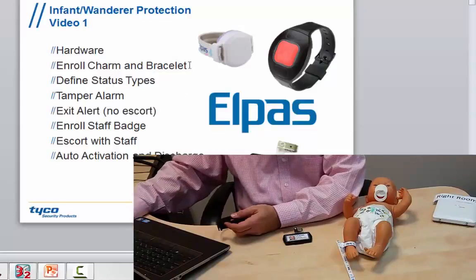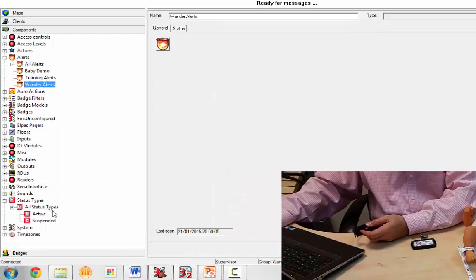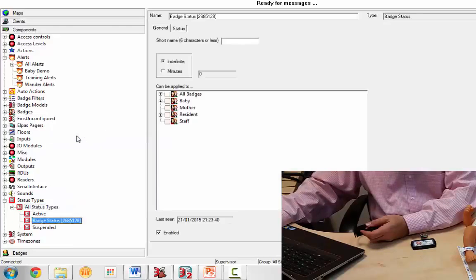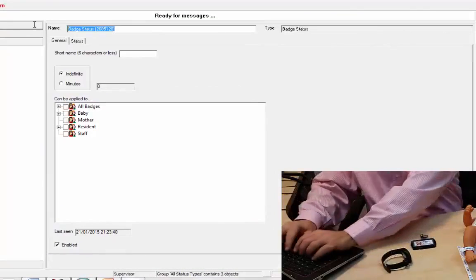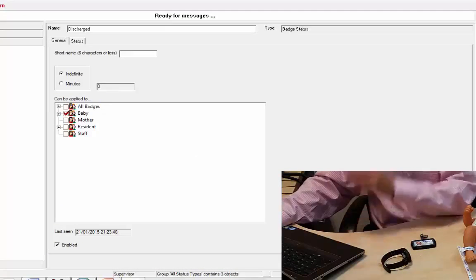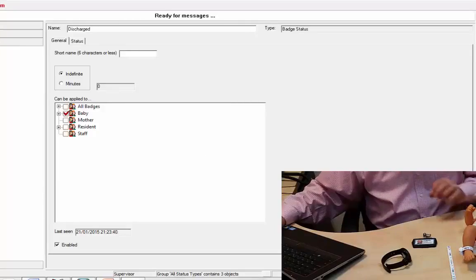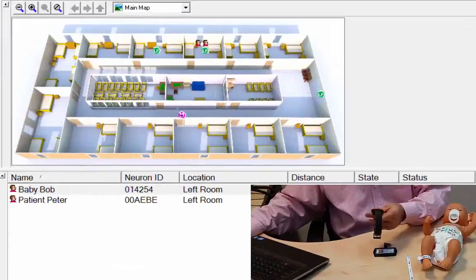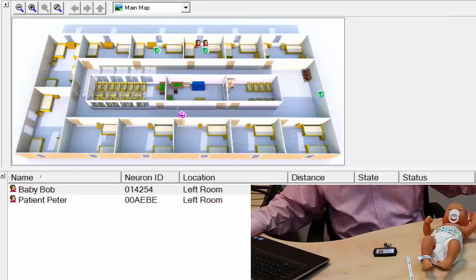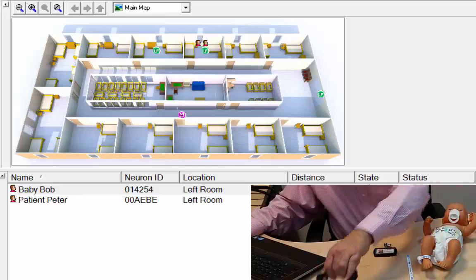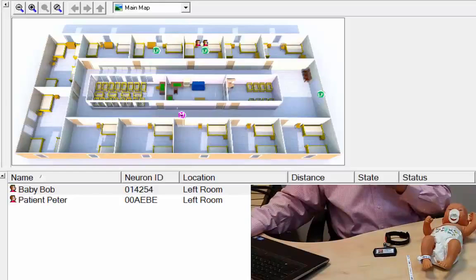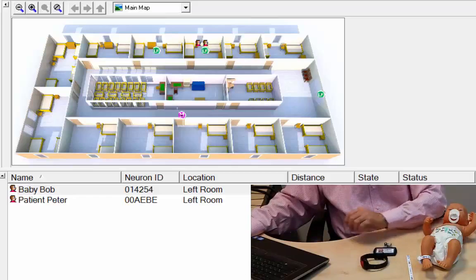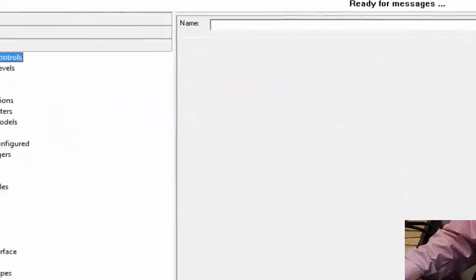We're going to define status types. So if we go down into our status types, we're going to add a badge status, and we're going to call it discharged. So we're going to apply it to the baby tag. At this point, again, we can look at the location of the patient Peter, move it into the right room, move it into the east exit, left room, and you see that that works pretty well. Now we're going to go ahead and define our alerts.